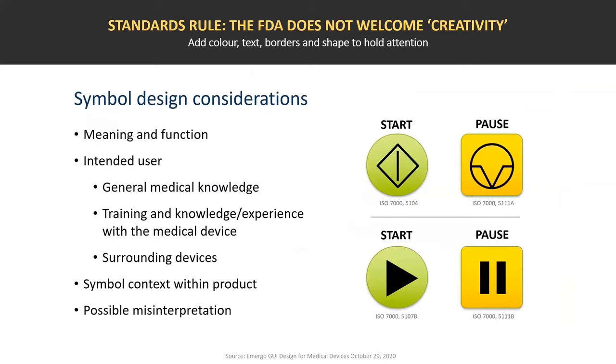It's been largely discredited because, quite frankly, it was seen by many people as being ridiculous that you were representing things on a screen that had a resonance with something that shouldn't be there, as is the name skeuomorphic. But in fact, when you use it in a medical environment, they actually perform better and they're clearer and people understand them.